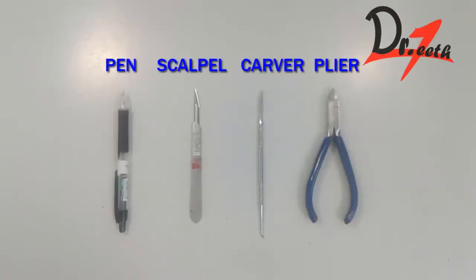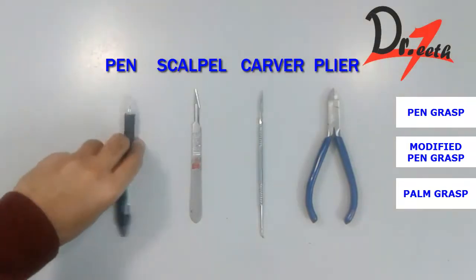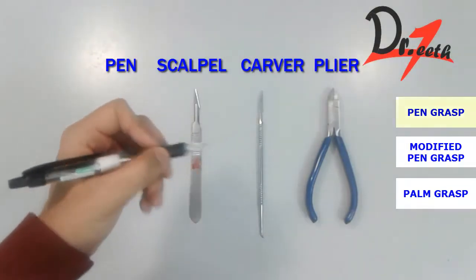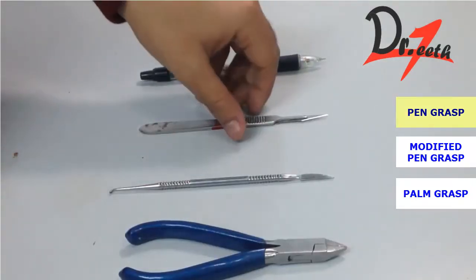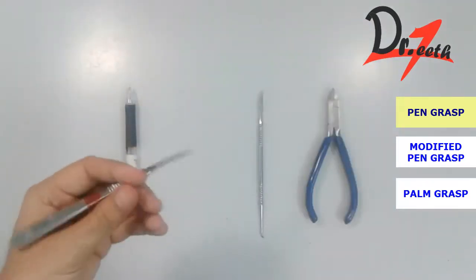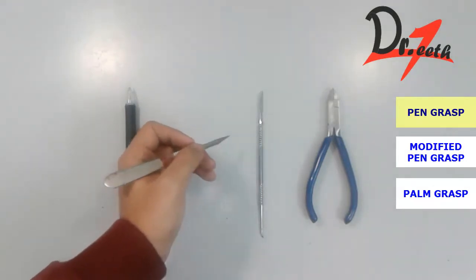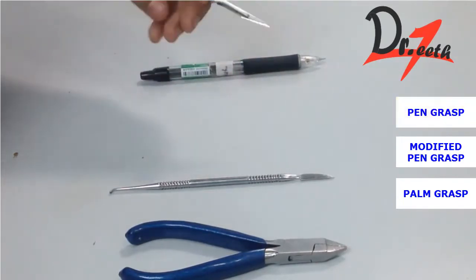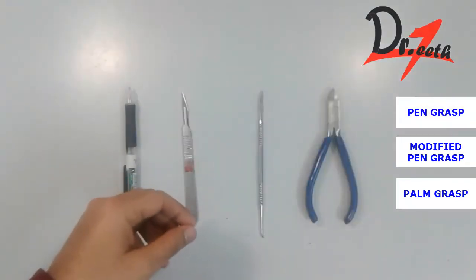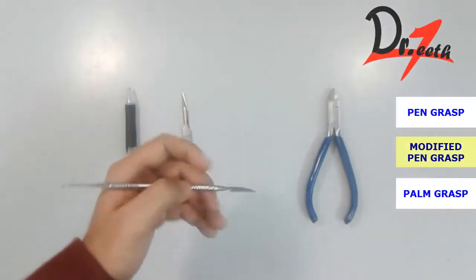In general, grasping techniques include pen grasp, modified pen grasp and palm grasp. This is a general pen grasp, how we use to write with a pen. Scalpel and other incising instruments use pen grasp for better precision. Almost all the dental instruments are grasped with a modified pen grasp for better control and stability.